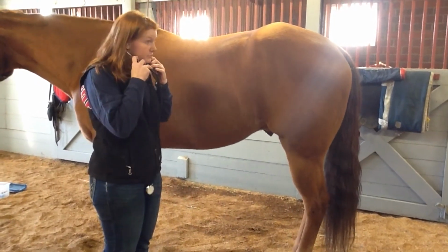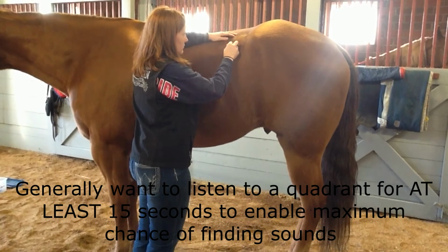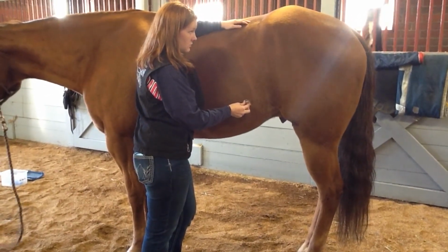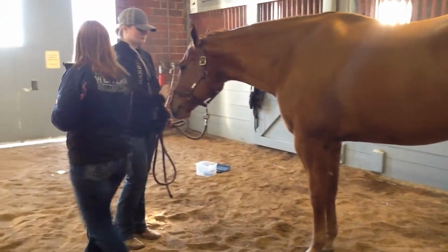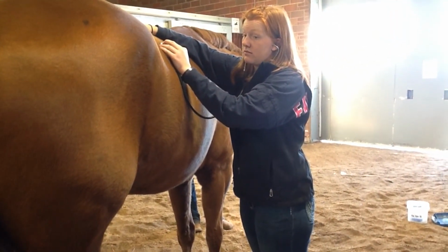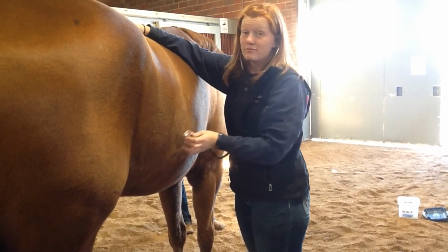So I'm going to put my stethoscope on. You can also do this by listening with your ear. You don't necessarily need a stethoscope if it is not at your disposal. In some horses, when you're doing this, you will have to sit here and wait to ensure that you have actual good, happy gut sounds. Alright, now that I've taken them on the other side, I'm going to take them on this side. I'm going to do the same thing. Happy, healthy horse.